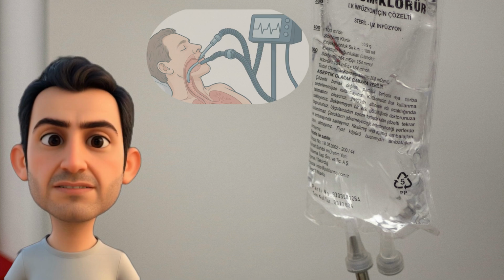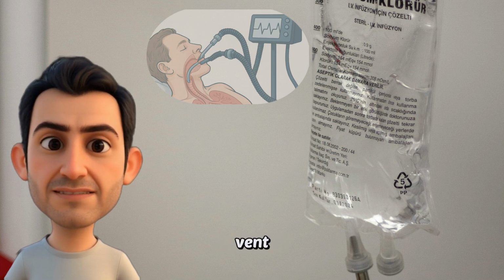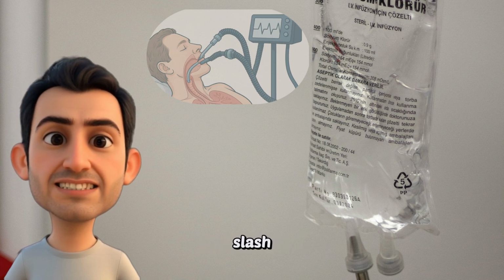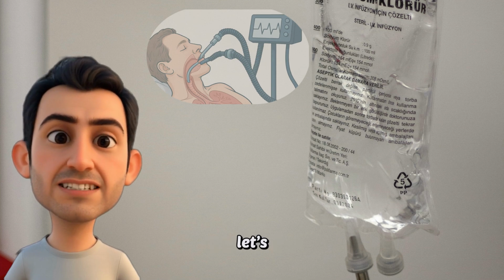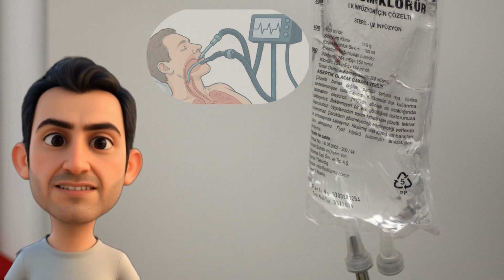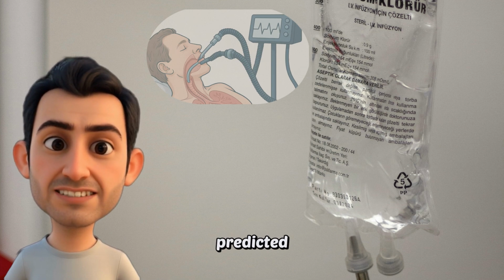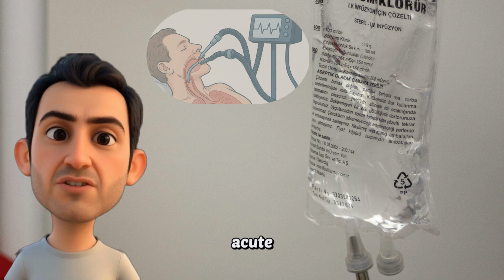Step 3. Setting up the vent. Okay, so you've intubated. Now you're staring at the vent. What mode do you choose? Go with volume assist control. That's AC/VC. It's reliable and it works for most emergencies. Now let's talk numbers and why they matter. Start with tidal volume. Aim for 6 milliliters per kilogram of predicted body weight. This protects the lungs, especially in ARDS or acute lung injury.